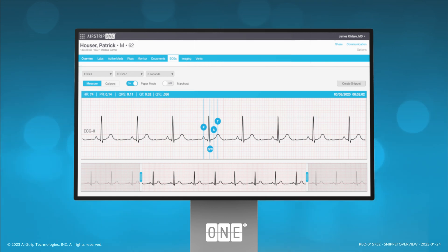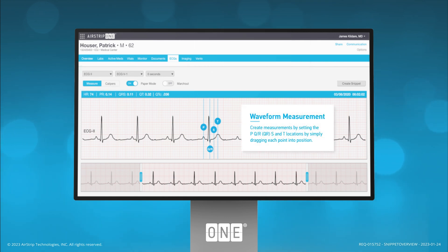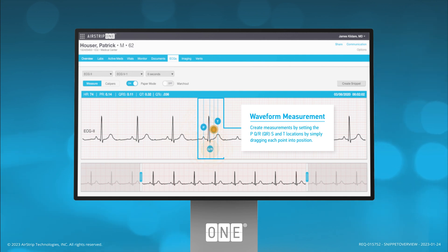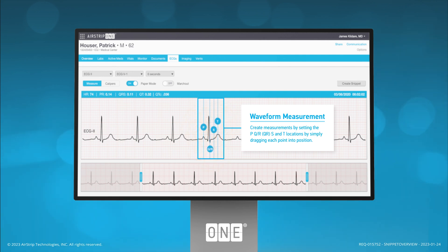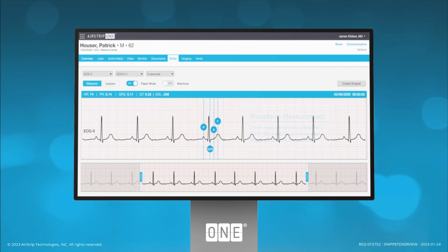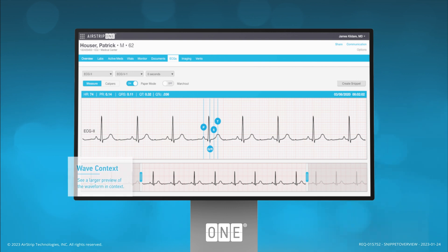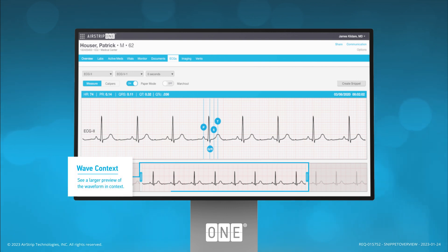Waveform Measurement: create measurements by setting the P, Q, R, S, and T locations by simply dragging each point into position. Wave Context: see a larger preview of the waveform in context.